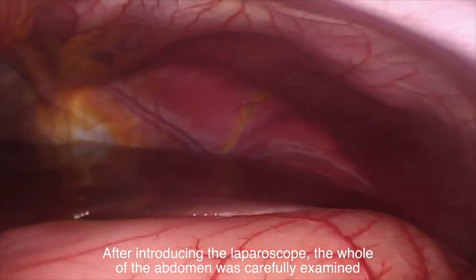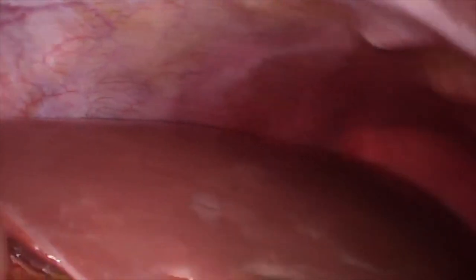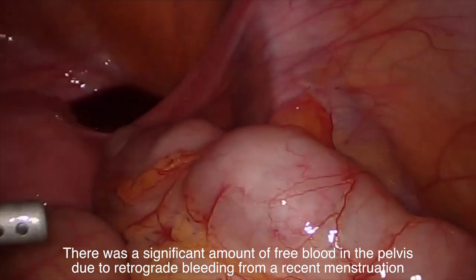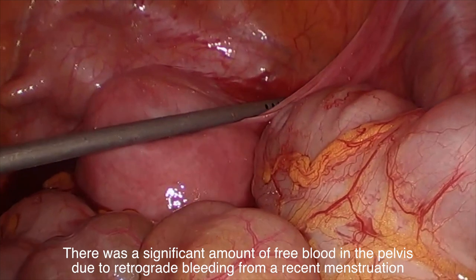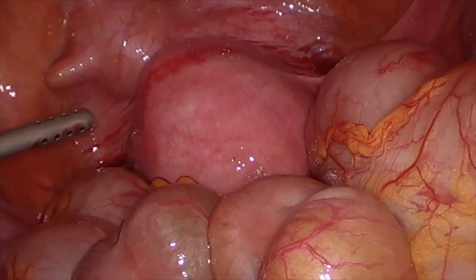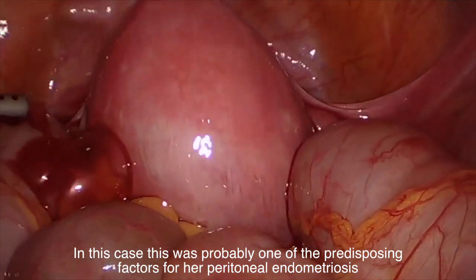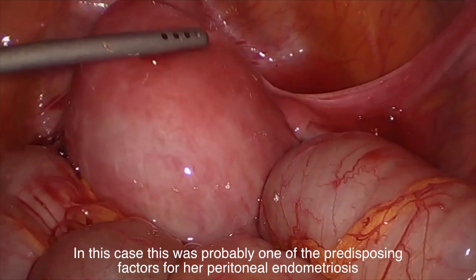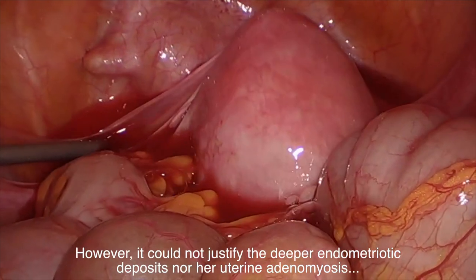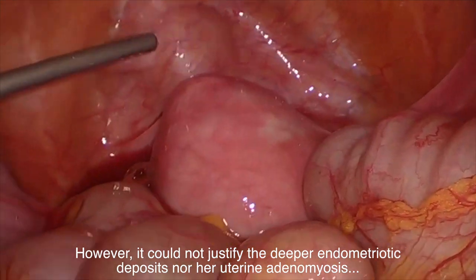The situation was discussed with the patient and she consented for a diagnostic operative laparoscopic procedure to remove pelvic endometriosis. After introducing the laparoscope, the whole of the abdomen was carefully examined. There was a significant amount of free blood in the pelvis due to retrograde bleeding from a recent menstruation. This was probably one of the predisposing factors for her peritoneal endometriosis, however it could not justify the deeper endometriotic deposits nor her uterine adenomyosis.